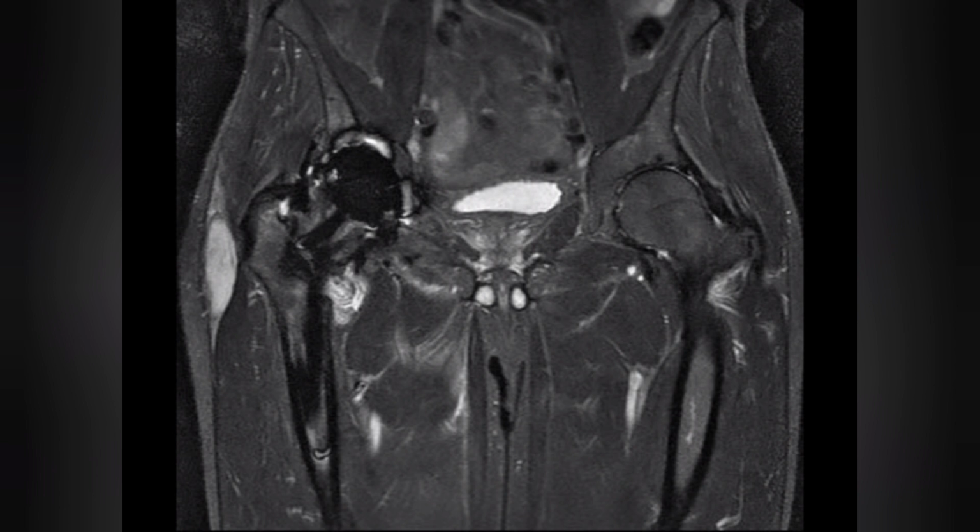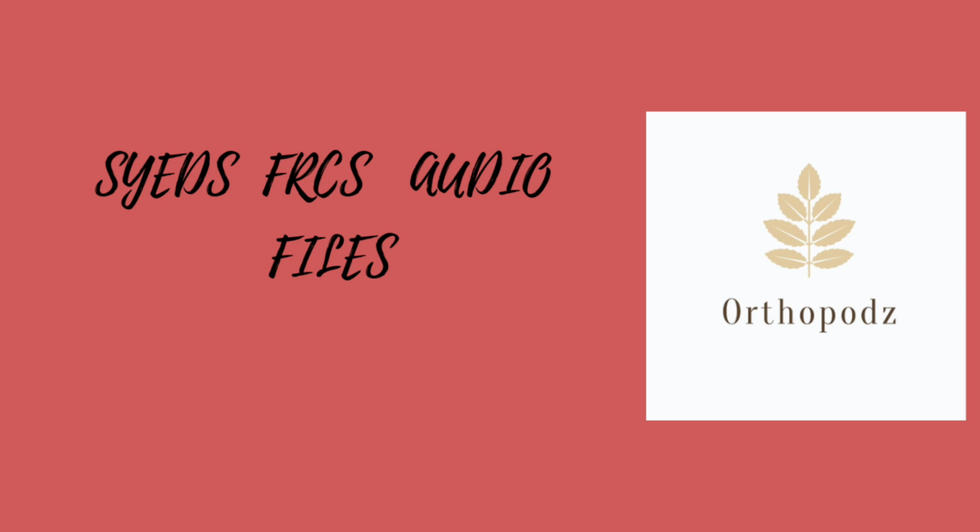Then contrast can be added in MRI. The contrast is gadolinium, and it enhances pathological tissue on T1. Risk of nephrogenic systemic fibrosis in patients with stage 4 CKD. Do not administer if eGFR is less than 30. Contraindications of contrast can be pregnancy, kidney disease, and previous sensitivity to contrast media.